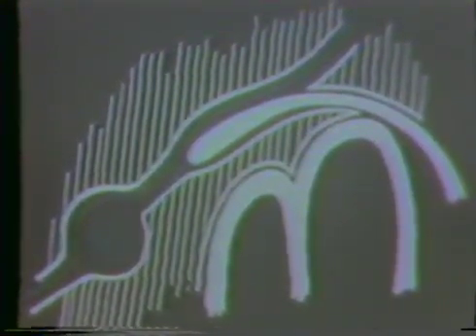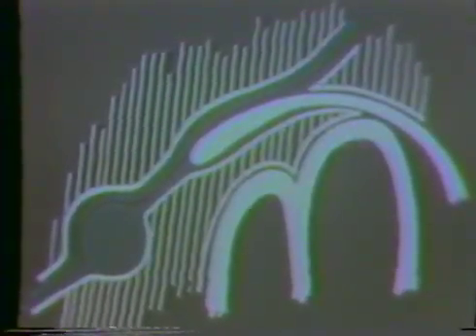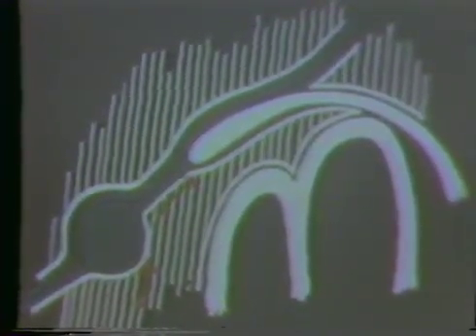The operation on the endolymphatic sac, which we have used for several years with good results, is based on the fact that many vertigos are caused by hypertension of the endolymphatic fluid in the labyrinth. Here we see an endolymphatic sac localized in the thickness of the dura mater, which surrounds the lateral sinus. This lateral sinus is our landmark.